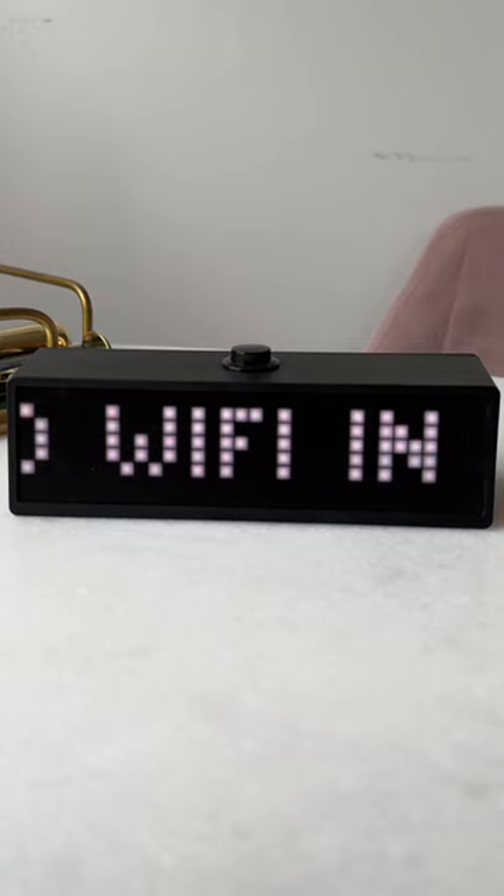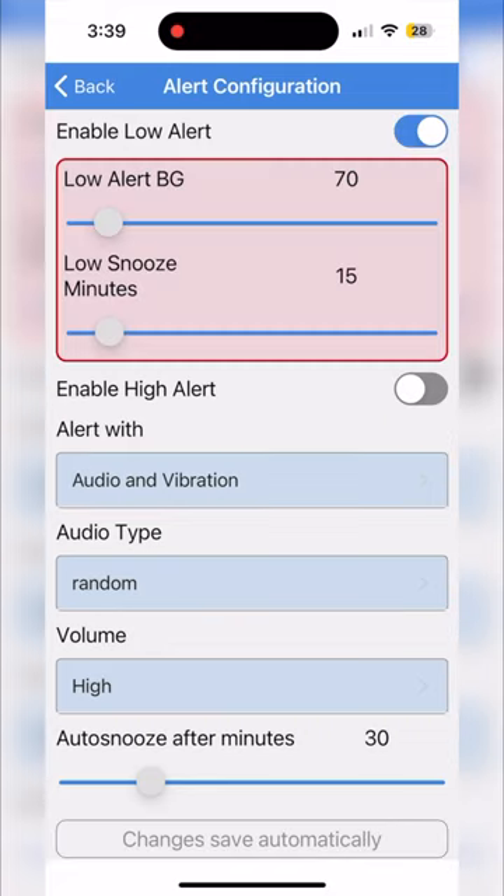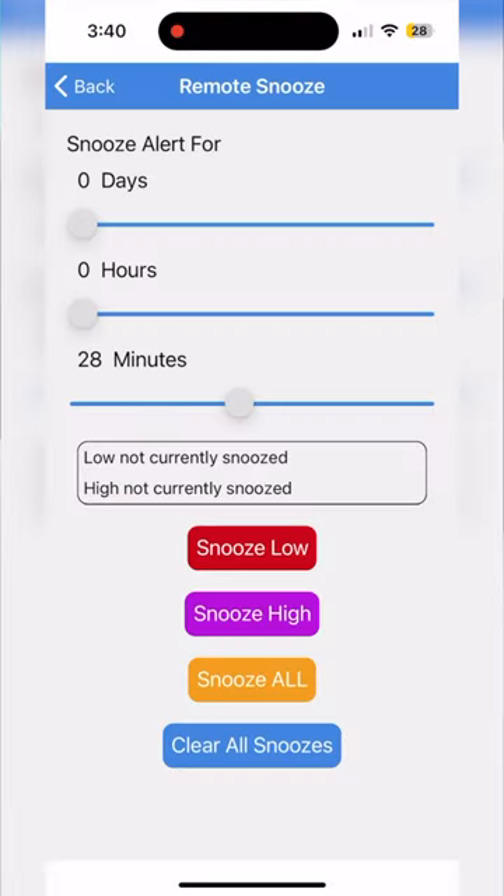You can adjust number and color ranges on the app. Optional high and low alarms can be set, and there's a snooze button. Snooze time can be adjusted.